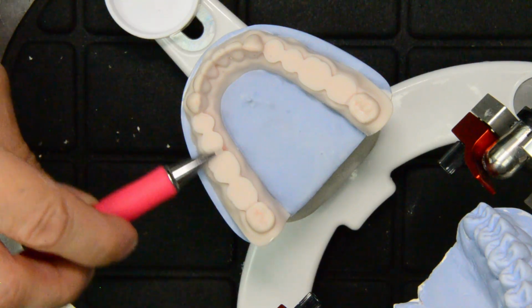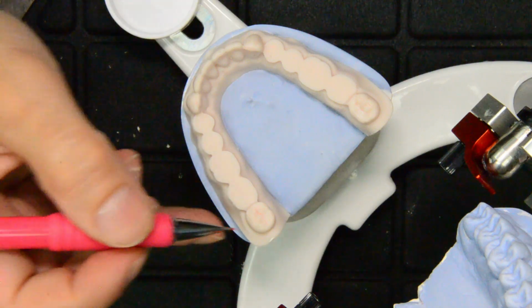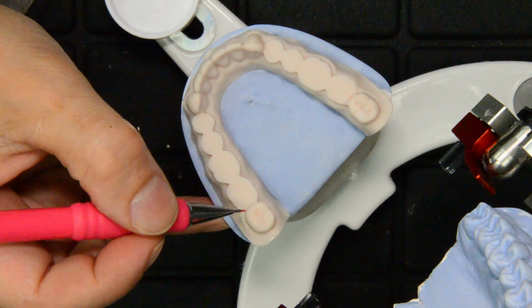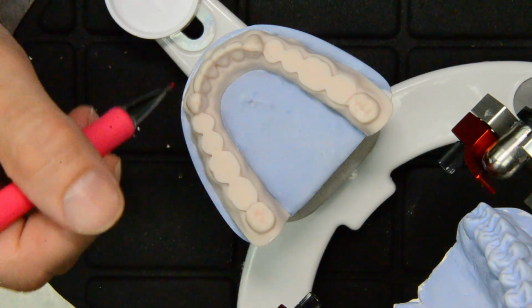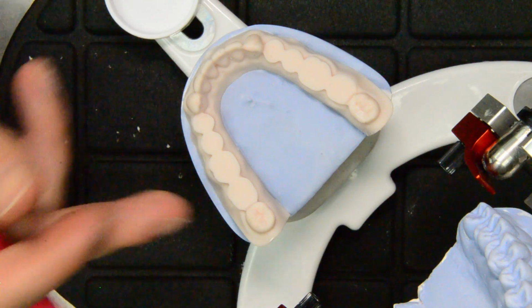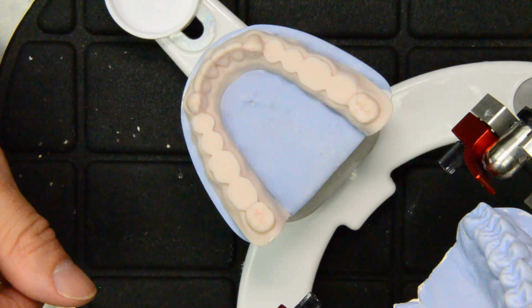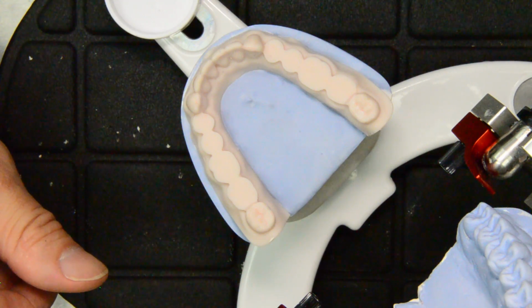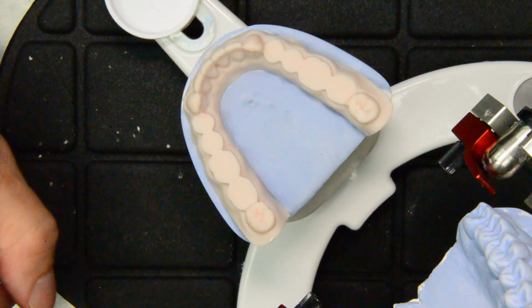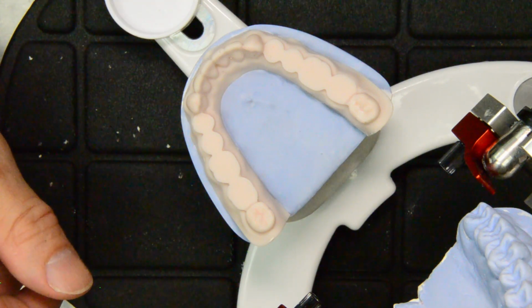Since it's so nicely and flatly cut, we can basically tell from the height of contour of the adjacent teeth where the boundaries of our teeth are. So in this way we can approximate where we're going to put our cusps and where we're going to put our fossas.